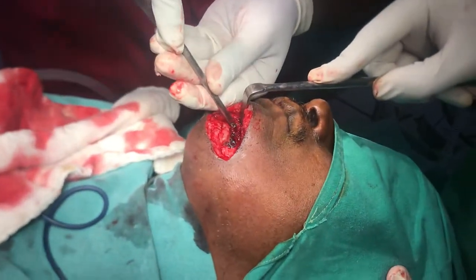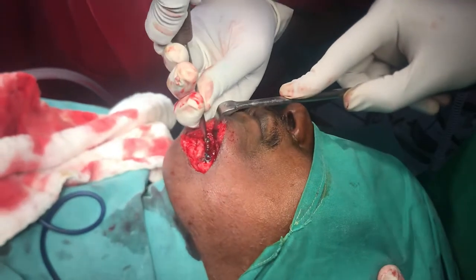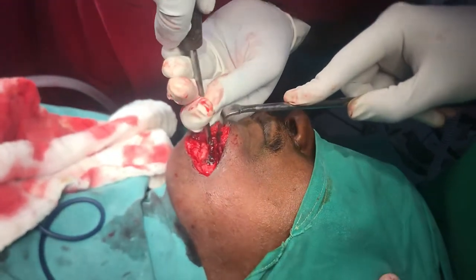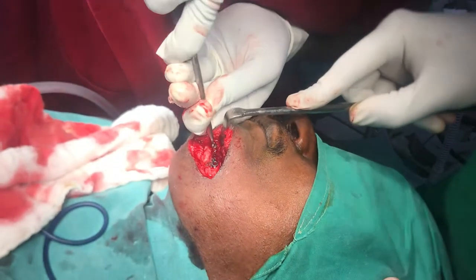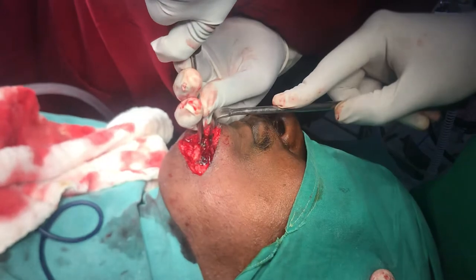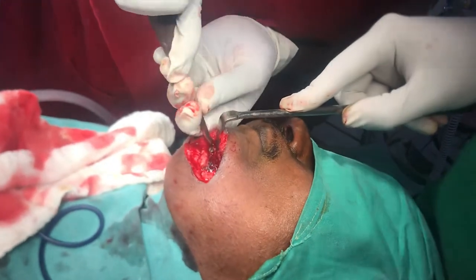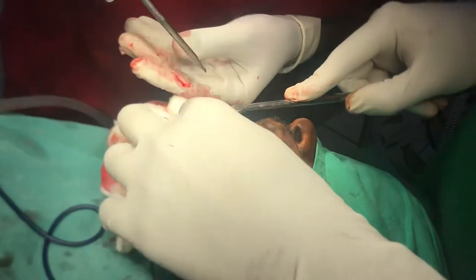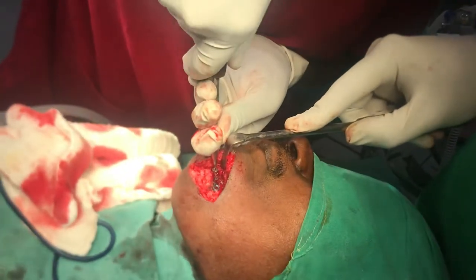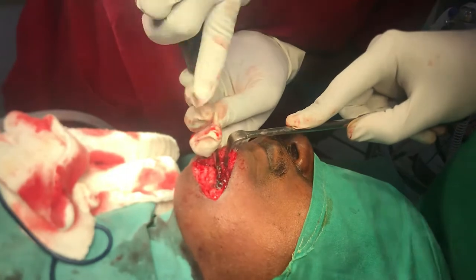Even though one of the screws seems to have been the reason for all of this infection in the sinus, the other two screws are really, really hard — as you can see, it isn't budging that easily. We have to remove all of them because the implant is also probably best removed now. There you see it slowly moves.